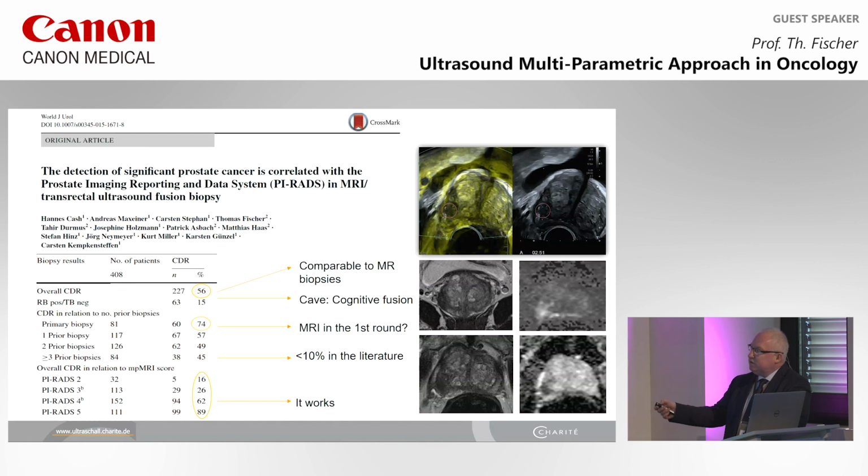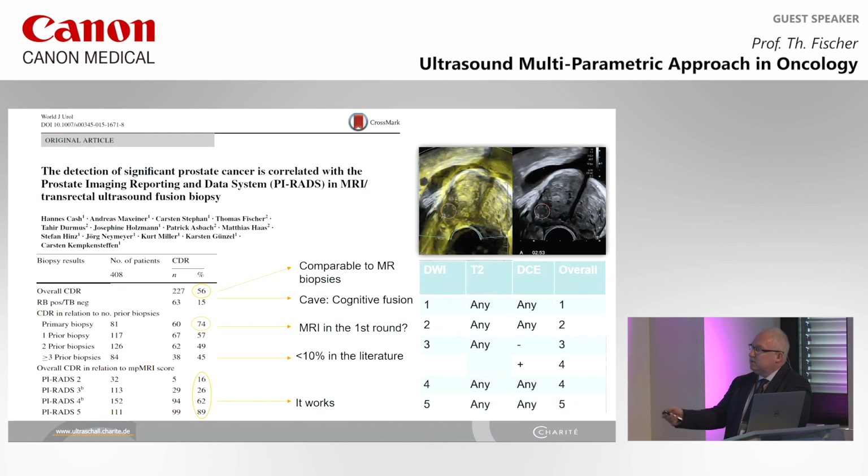And you see, first of all, you need good MR stuff. You need the PI-RADS classification. And to solve the problems, we deal with the image fusion or targeting biopsy. And this setup is based on the PI-RADS classification, which is very important. And by the way, interestingly for me, the dynamic contrast enhanced MR plays only a role to make a decision in PI-RADS category 3, yes or no, to downgrade or upgrade your lesion.